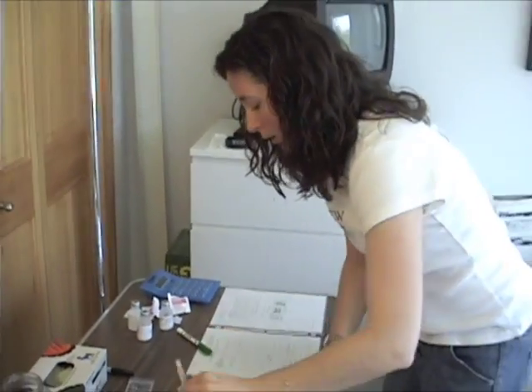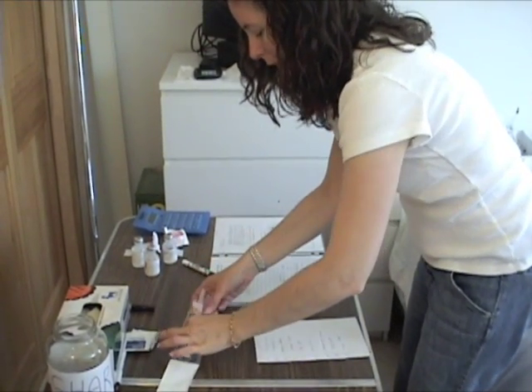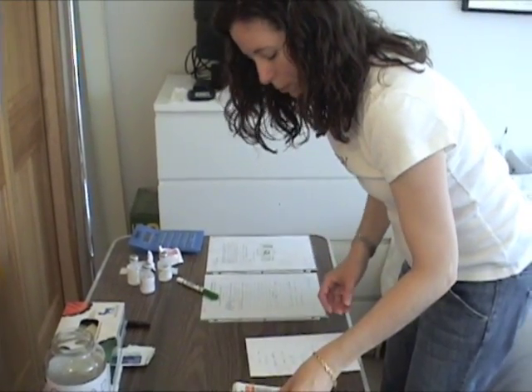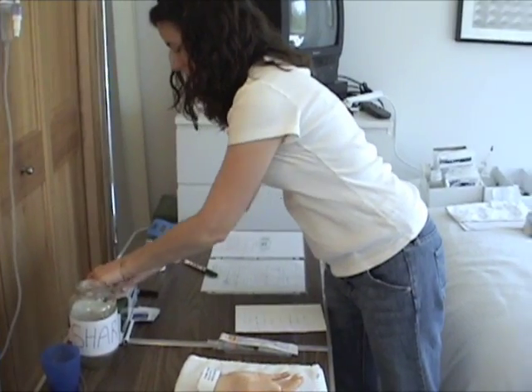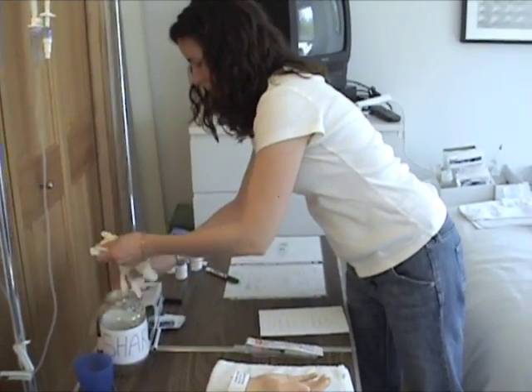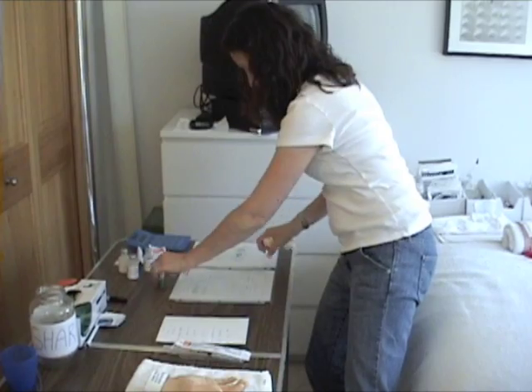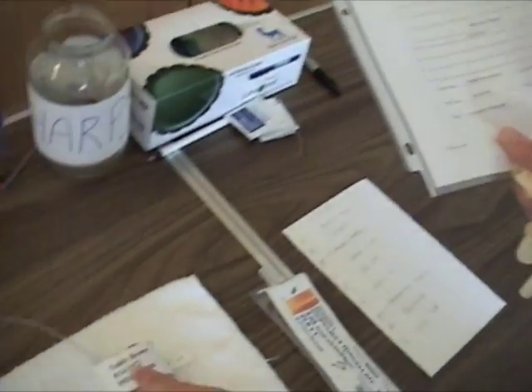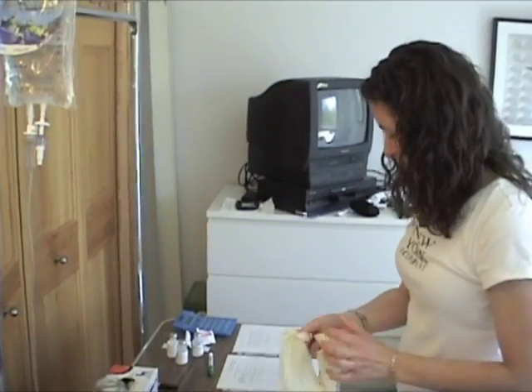I'm going to recap my needle because I need to still give the medication to the patient, and I like to put it back into the pouch for sterile purposes. Put it here. My next thing will be to ID my patient. So I can grab my gloves just to have them in my hand. Grab my MAR. Go. So we have Teddy Brown, 91472, 91472. Very good, I have the right patient. So I'm going to put my gloves on.